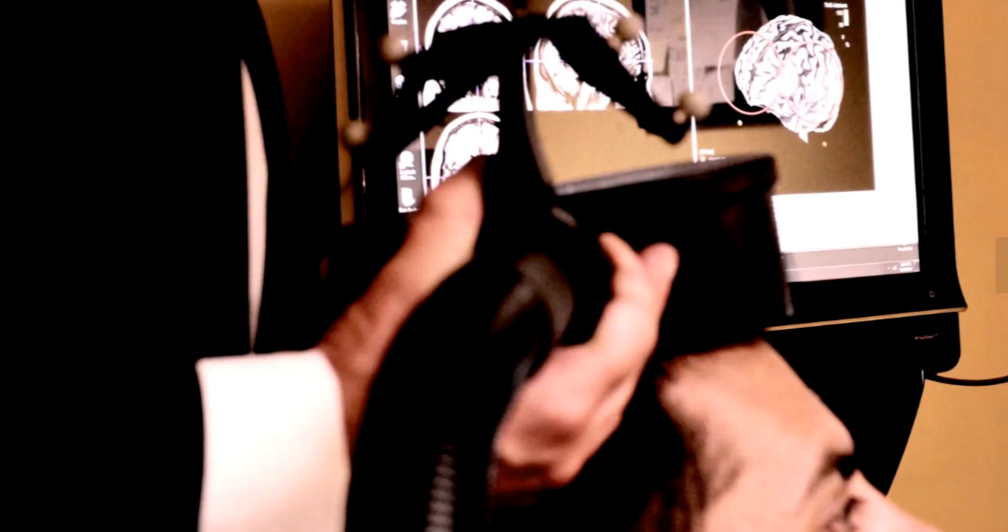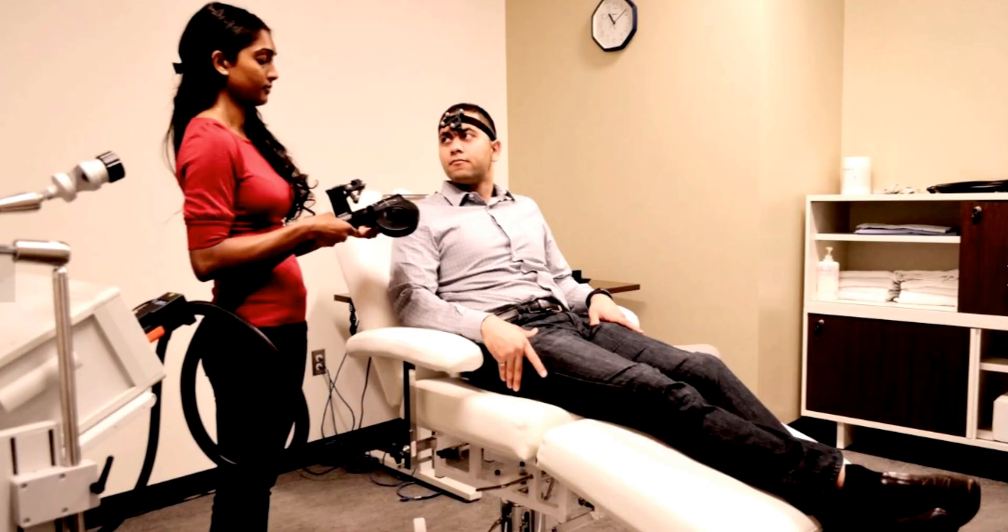Now that compares favorably to medications and therapy for people who have already tried at least two courses of medication or psychotherapy. So where RTMS lives in your treatment algorithm is usually after medications and therapies have been tried, but before going to a more invasive option such as electroconvulsive therapy or ECT.